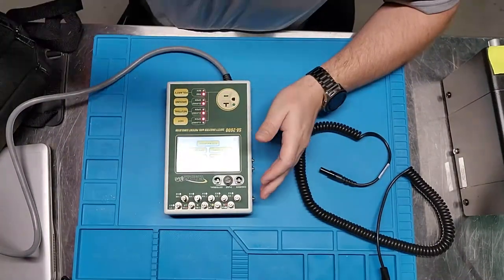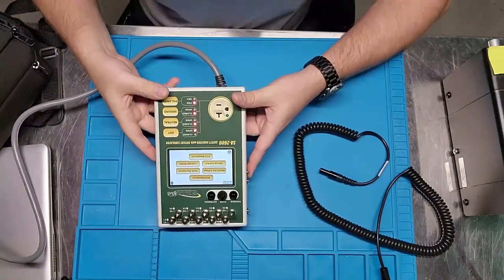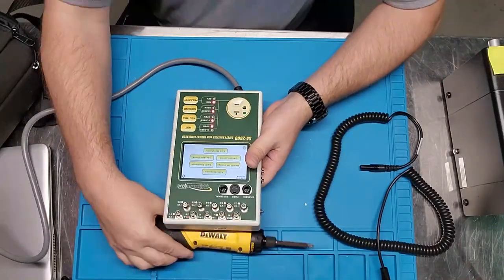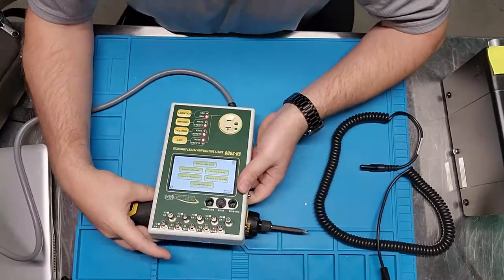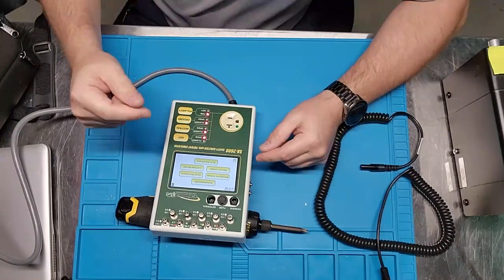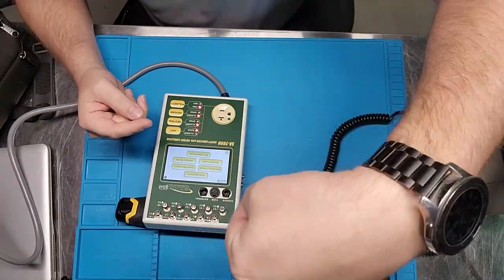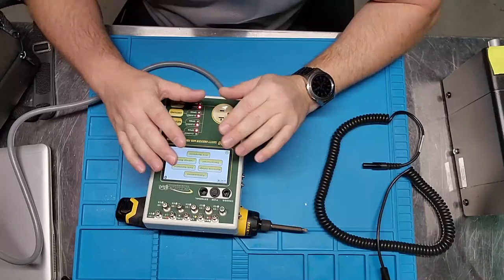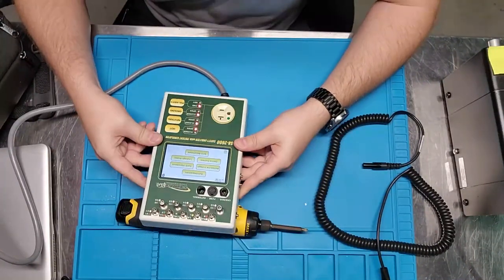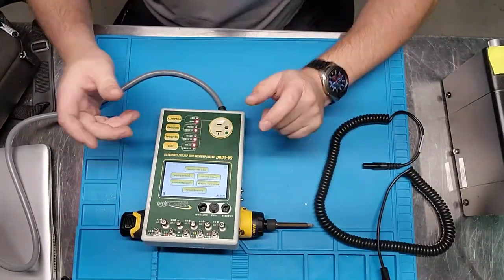One of the things I want to show you is how responsive the touch screen is. Let me angle this correctly — the LED overhead lights give me a complete washout on camera, but I can see the screen quite easily even at the angle I'm operating it. The screen is actually pretty bright.